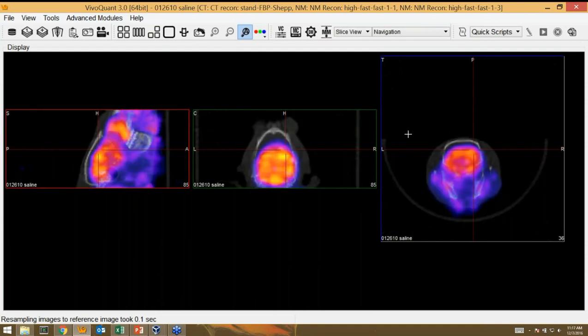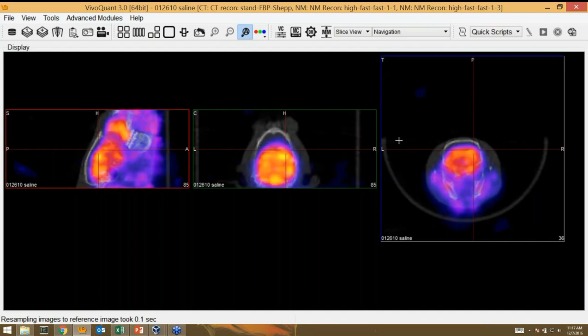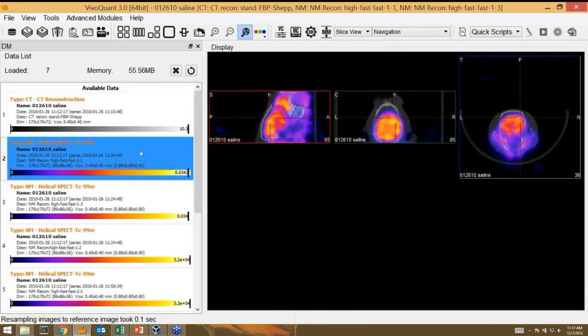We can also go left to right, essentially pulling the bottom of the color palette up, hiding those low intensity values. We've also extended this beyond just our traditional min and max representation of the color palette.